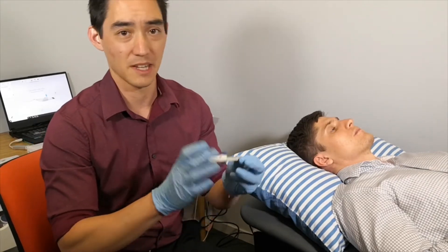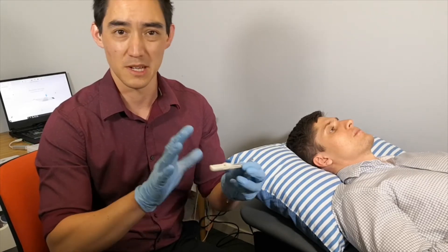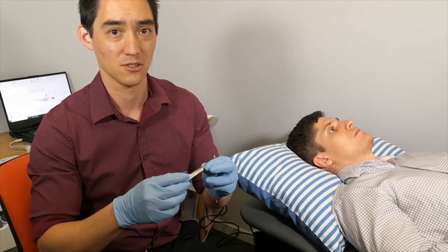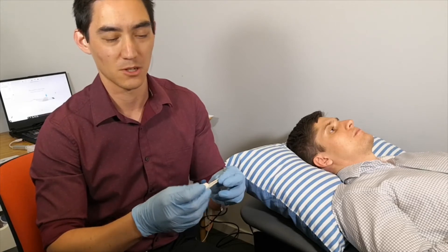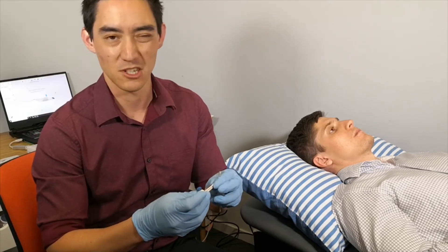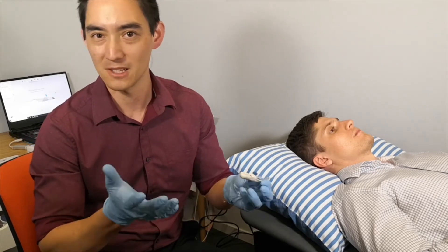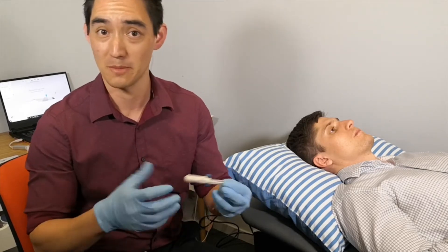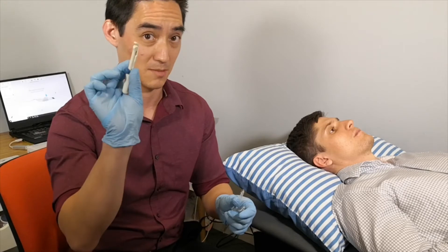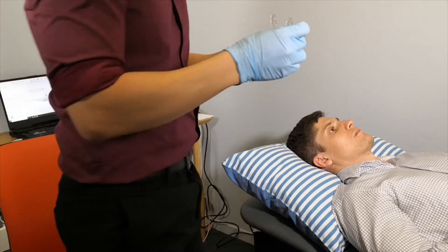Generally speaking, this is going to depend on what you've been taught or who you've learnt from. But we're looking at how much the patient can protrude the jaw to maximum protrusion and then back to centric relation. We're trying to figure out what percentage — how far forward we're going to bring them from centric relation. We're generally starting about 50%, though everyone's going to have different ways of doing it. So firstly we've got to set up the gauge to have the lower incisor notch fit around the patient's lower incisors.